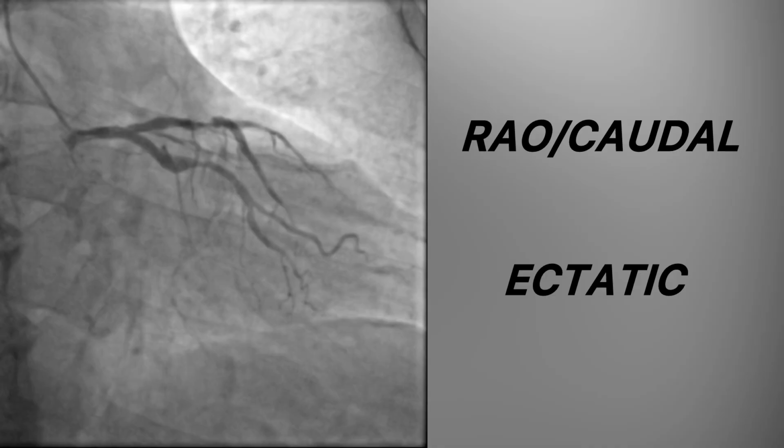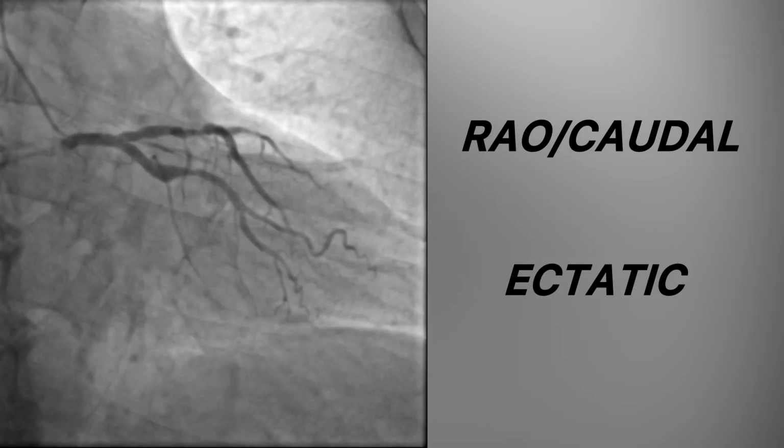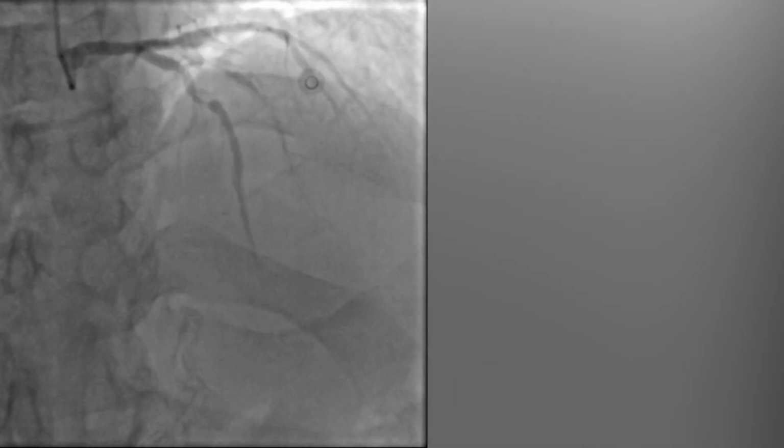In the initial angiographic views of the left coronary system, the proximal LCX appears markedly ectatic. At first glance, there seems to be a significant stenosis distal to the ectatic segment. However, after careful comparison with the distal reference vessel diameter, it becomes evident that this lesion is not hemodynamically significant, and therefore medical management is the most appropriate strategy.